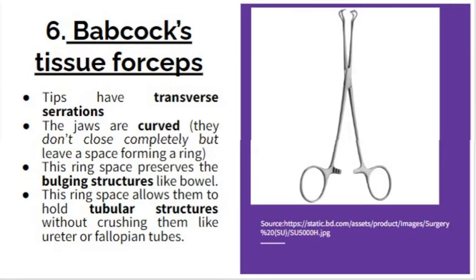The next one is the Babcock tissue forceps. Whenever we talk about a tissue forcep, it means the jaws don't touch each other completely — they have some space between them, which is why they are called tissue forceps. The Babcock tissue forceps has transverse serrations only at its tips. The jaws are curved and don't close completely, leaving a space that looks like a ring. This ring space preserves bulging structures like bowel and also allows holding tubular structures without crushing them, like the ureter or fallopian tubes.